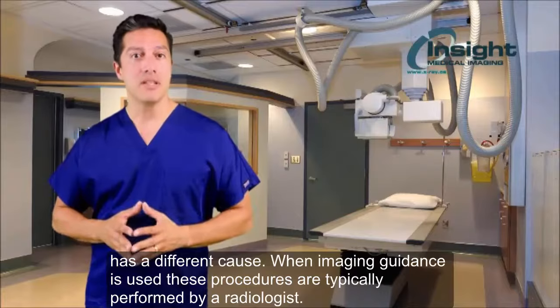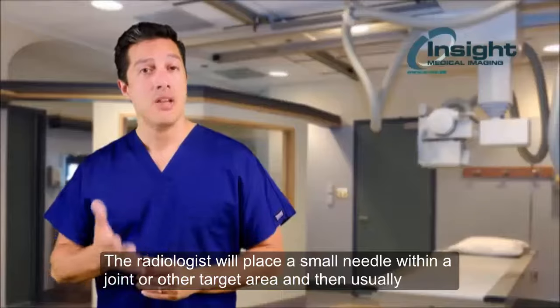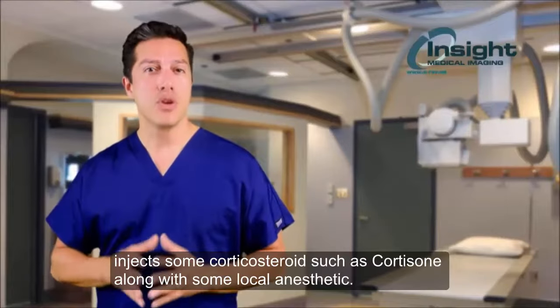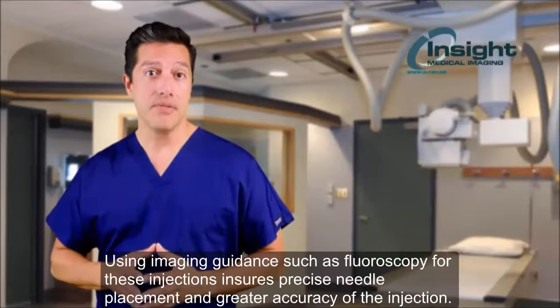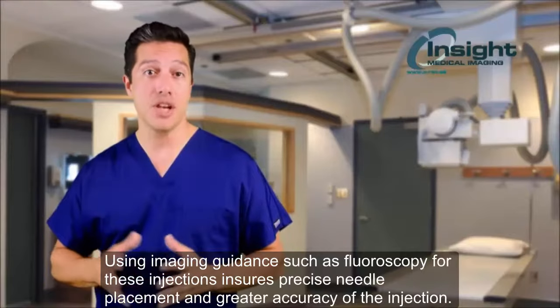When imaging guidance is used, these procedures are typically performed by a radiologist. The radiologist will place a small needle within a joint or other target area and then usually injects some corticosteroids such as cortisone along with some local anesthetic. Using imaging guidance such as fluoroscopy for these injections ensures precise needle placement and greater accuracy of the injection.